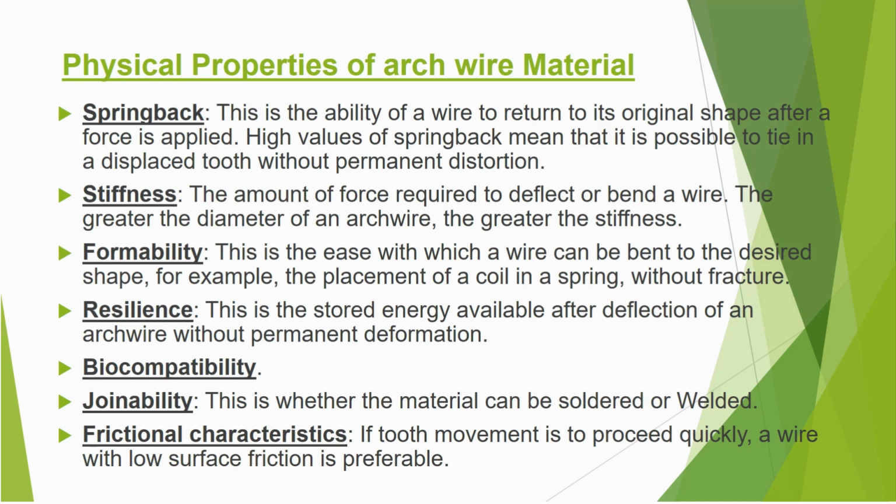Biocompatibility. Arch wire should be biocompatible. Joinability. This is whether the material can be soldered or welded. Frictional characteristics. If tooth movement is to proceed quickly, a wire with low surface friction is preferable.